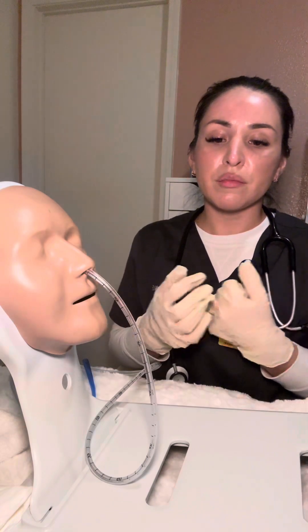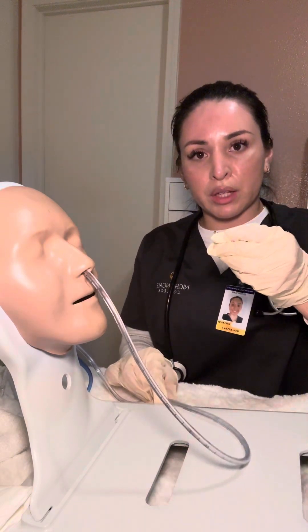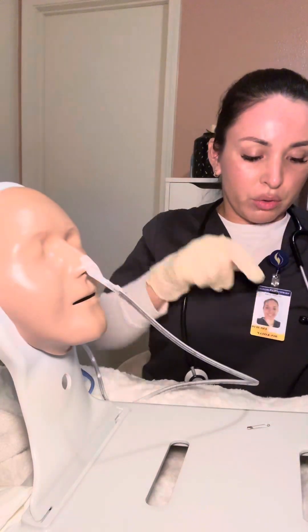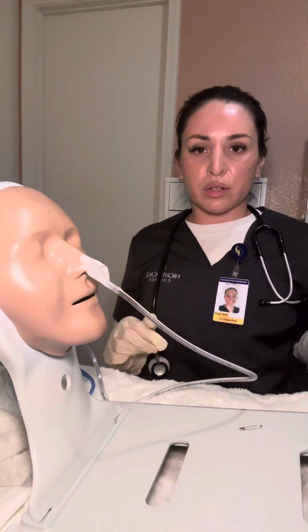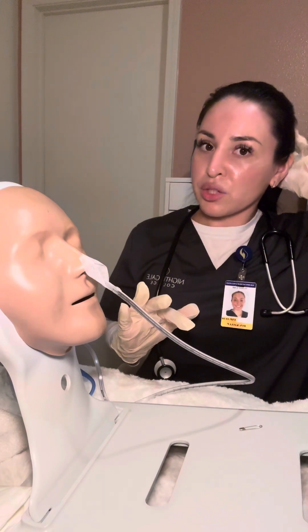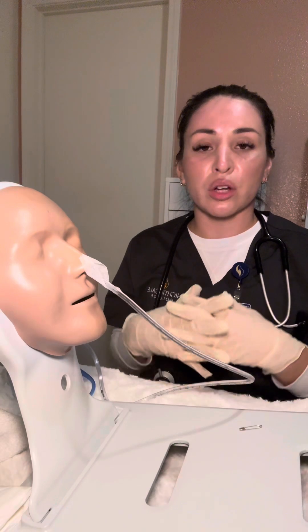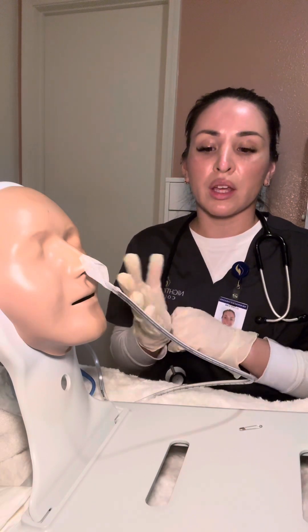We're going to safety pin the tubing to the patient's gown in a comfortable place. Then grab the tape and secure the tubing — looping tape around one side, then the other. Once done, we lower the bed, place the patient in a comfortable position, and make sure the call light is nearby. We document everything we did, clean up the area, remove gloves, and perform hand hygiene. And that's it.